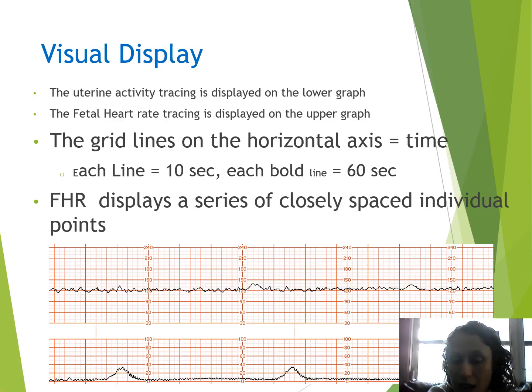So let's go over what we see with the fetal monitor. If you look at this, each bold line is 60 seconds, and each little line is 10 seconds. I know it's a little harder to see, and it's super tiny on my screen, but the big bold lines are 60 seconds, and the smaller lines are 10 seconds, okay? So remember the big bold lines as your minute, right?